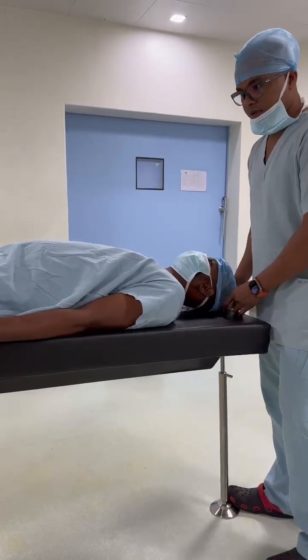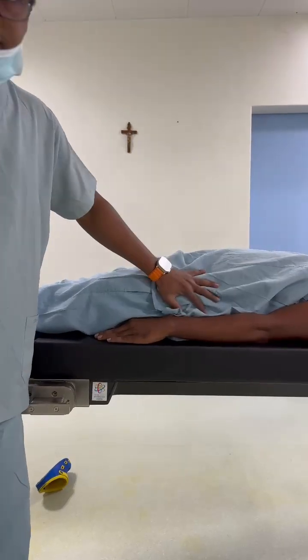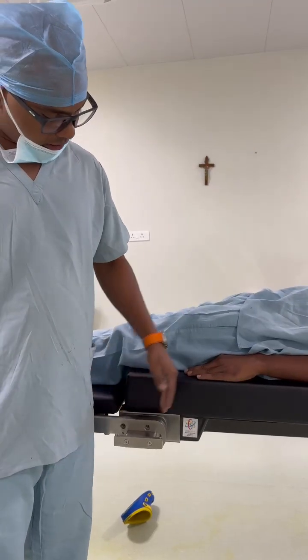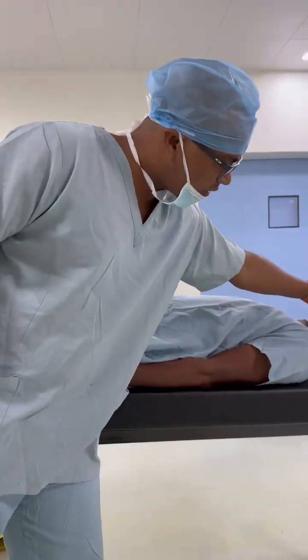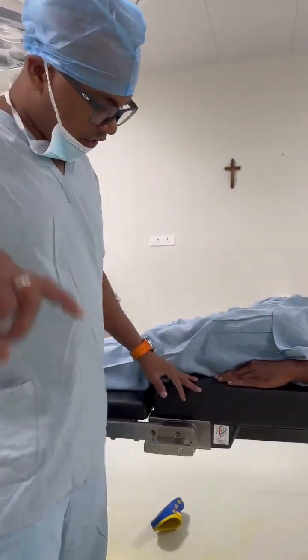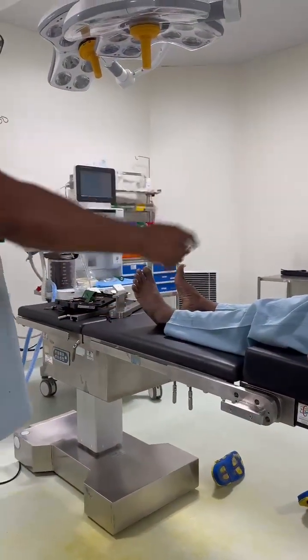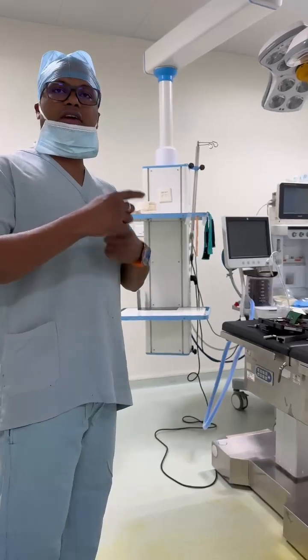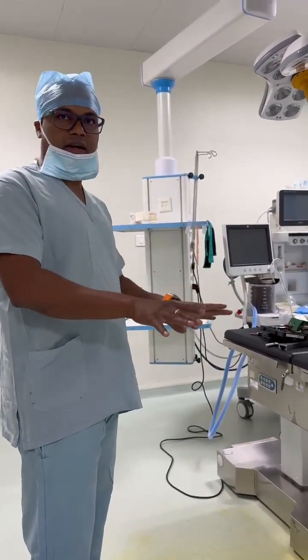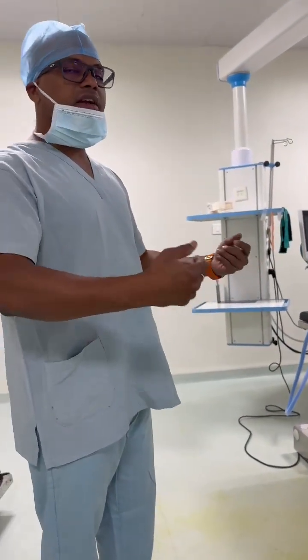Unlock. Now you can see — my patient's pelvis is here, and it is almost covering half of the extremity, so the metal-free region starts from here. It can cover the entire spine — head to pelvis — entirely metal-free. So the table is entirely out of the way. My C-arm can go freely, and the technician can take a single shot and complete the X-ray and come back. This eliminates multiple shots caused by metal interference in the surgical table.